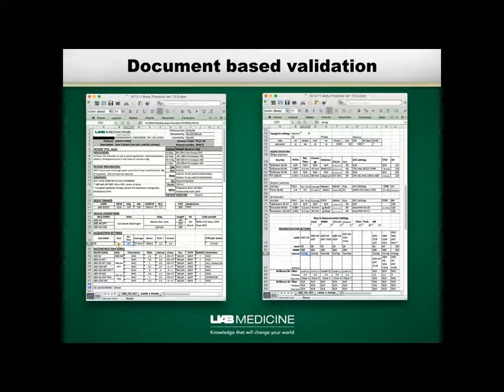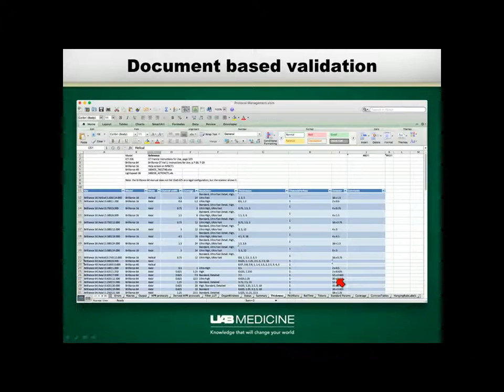Now, the way I do this is each one of these protocol pages has two sections. There is this section, which is what I generate that PDF file from, and that contains some information, like the indications, that is just hard-coded in there and doesn't change from one scanner to another. But all this stuff down here has Excel functions in it that refer to the second section of this worksheet, which is what I call the database, where for each different scanner model I have the information that will vary from one scanner to another. And I've got the acquisition section up here and the reconstruction section down there.